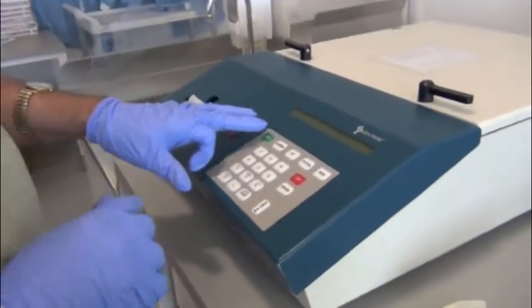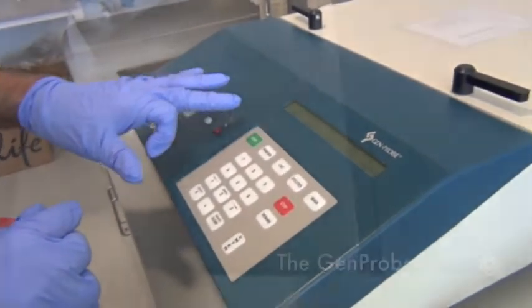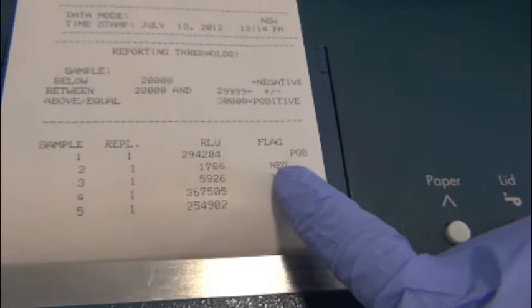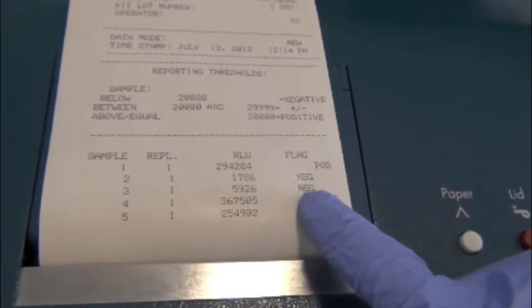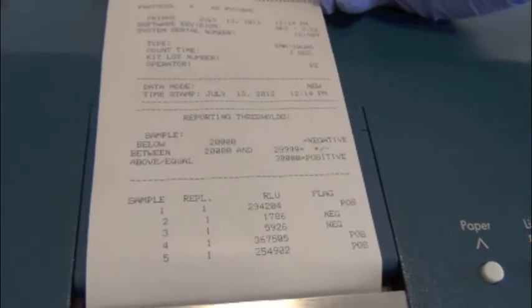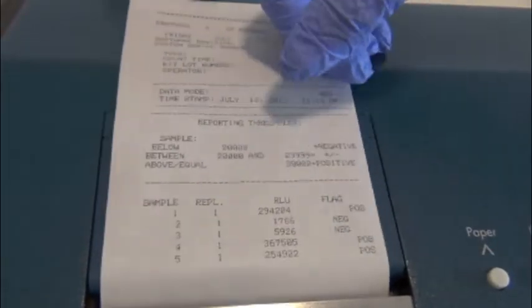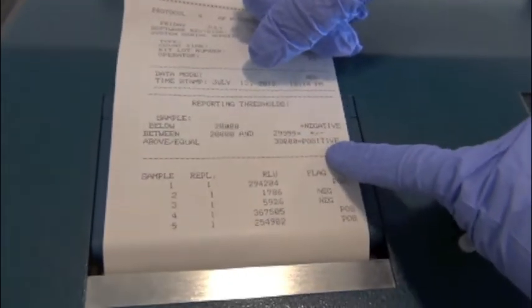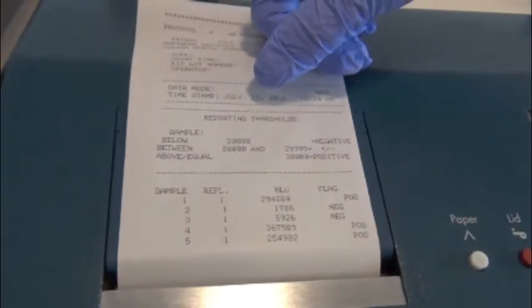Okay, so we're going to hit start. The first is our positive control. This is our negative control. Our first patient was negative, and our last 2 patients were positive for gordonae. And here it says positive. Anything above 30,000 is considered positive. Alrighty, that's done. All right, so it worked.